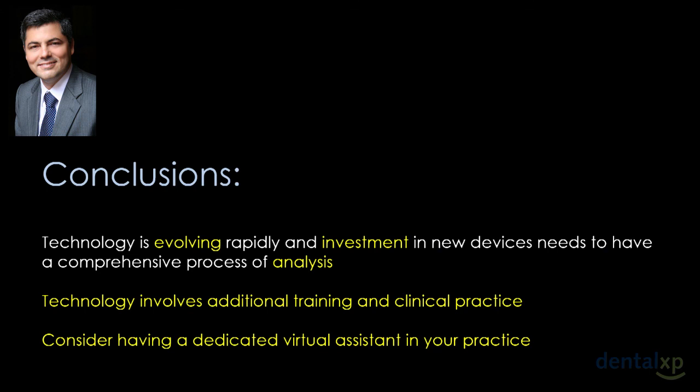So the conclusions: the technology is rapidly evolving. There is a major investment that you are making in your practices. When you make that investment, you need to have a plan. You need to get into that investment with a solid plan in mind. How is it going to pay back? How are you going to implement it into your patients? What is it going to do for you in your practice? So you need a comprehensive process of analysis, not just the fact that you're going to have to spend time in the training to be able to get the expertise, because you want everything to flow as you are doing the process.